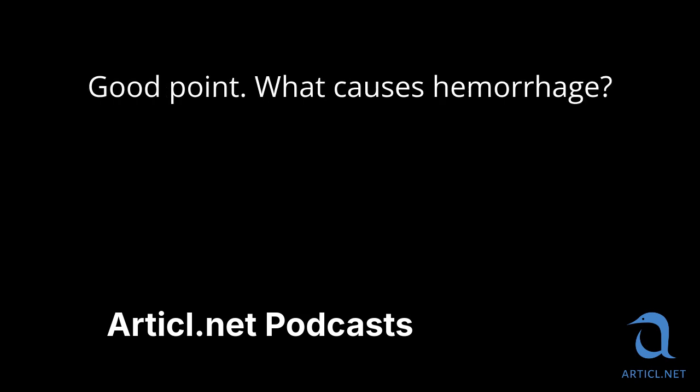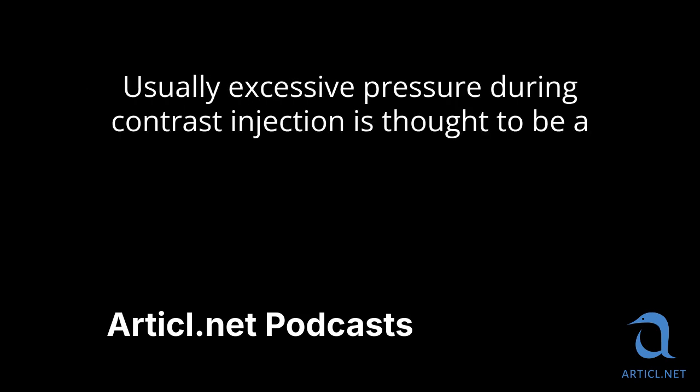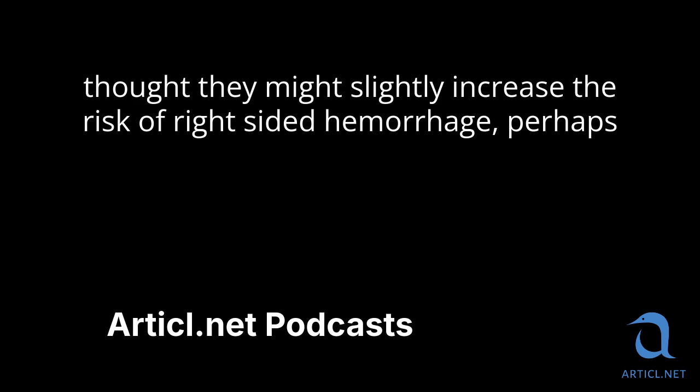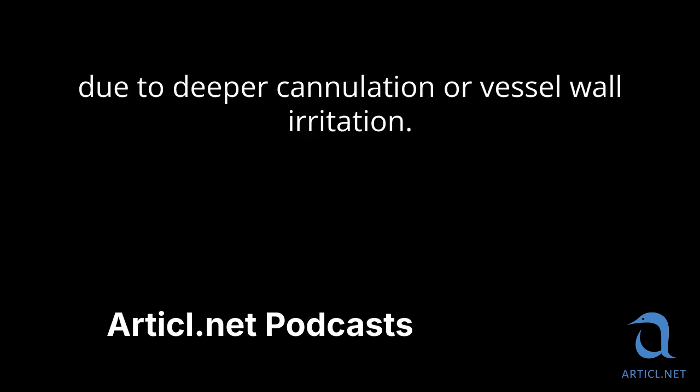Good point. What causes hemorrhage usually? Excessive pressure during contrast injection is thought to be a primary cause, and while microcatheters help with selectivity, there's some thought they might slightly increase the risk of right-sided hemorrhage, perhaps due to deeper cannulation or vessel wall irritation.